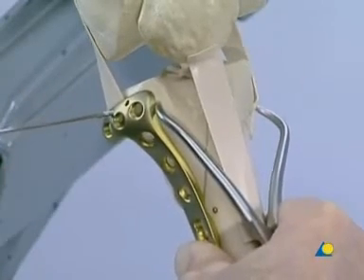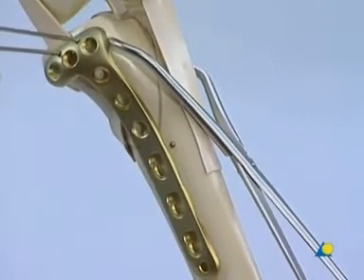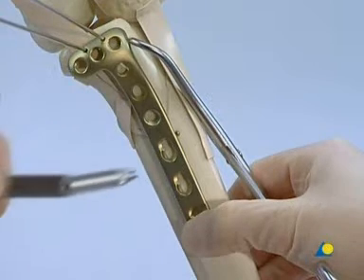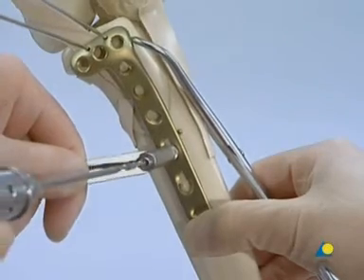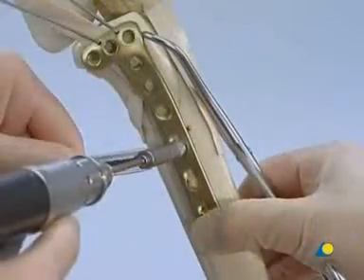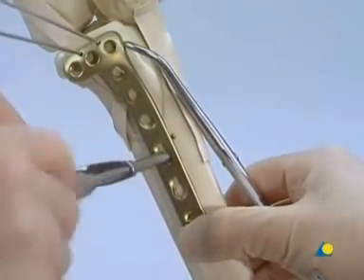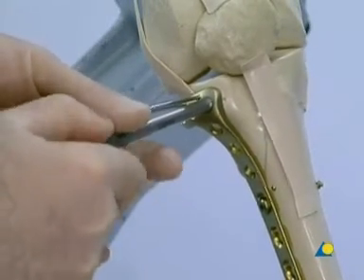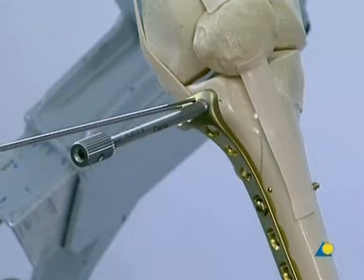The LCP is fixed temporarily with two K-wires. Before placing any screws, it is advisable to check the quality of the reduction with X-rays in two planes. The first screw is inserted through the plate hole just distal to the apex of the fracture; the 4.5-3.2 universal drill guide is used in the neutral position. Both cortices are drilled through using the 3.2 mm drill. After measuring and tapping, the 4.5 mm cortex screw is inserted. The 5.0 threaded LCP drill sleeve is screwed into the most anterior of the proximal plate holes to show the direction of the most proximal locking head screw.